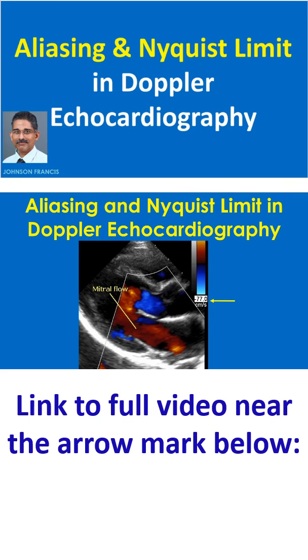Nyquist limit of the color Doppler is displayed at the upper and lower ends of the color bar, which may be displayed either on the right upper corner or left upper corner. Here the flow away from the transducer in blue color has a Nyquist limit of -77 cm per second.